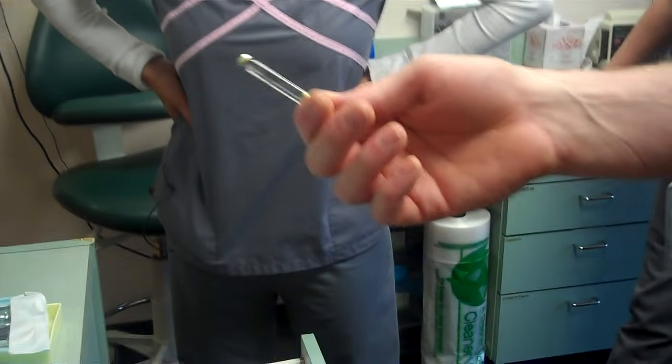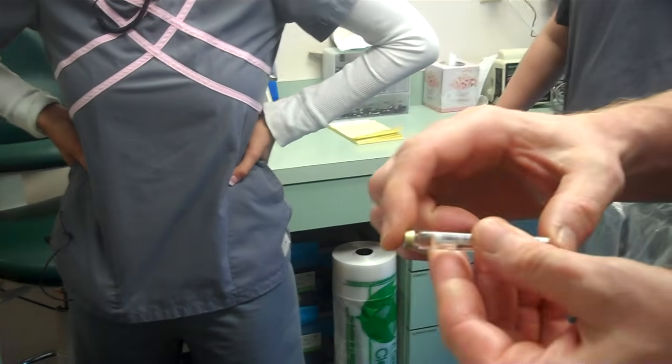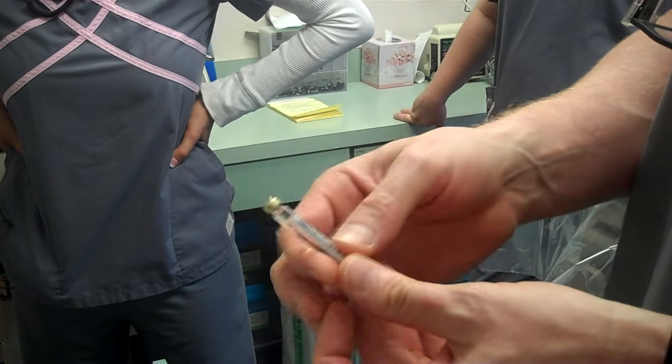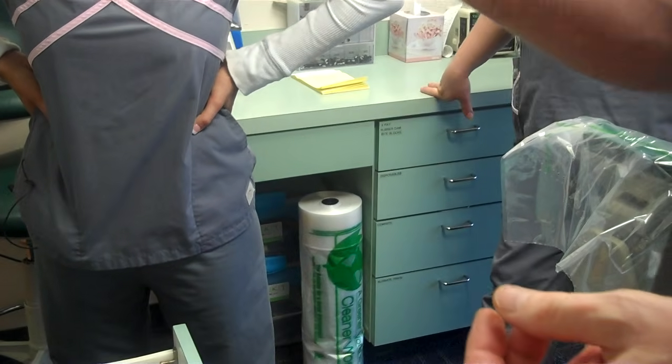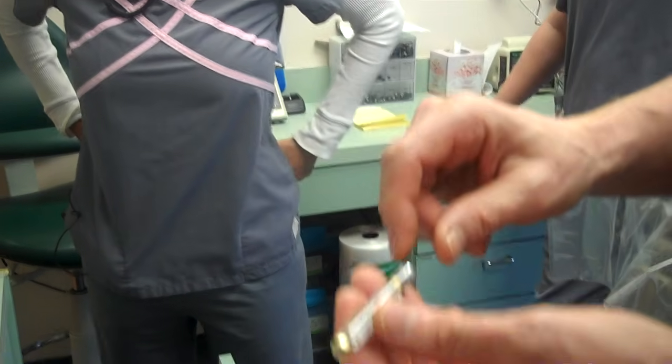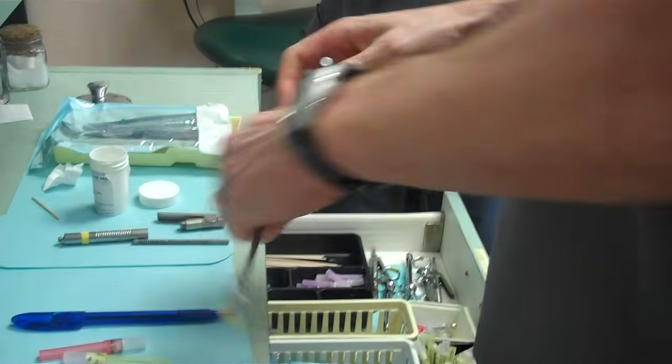Right here. Septacane. We use Septacane virtually everywhere except for lower blocks. That means if we're going to do any upper tooth and every single lower tooth except for lower molars, we're going to use Septacane. We're going to use Septacane in a regular syringe. You place it like that, and we're going to use a 30 gauge needle, which is a blue.